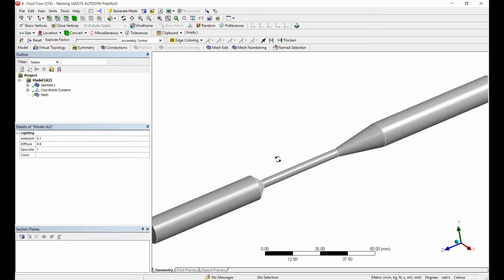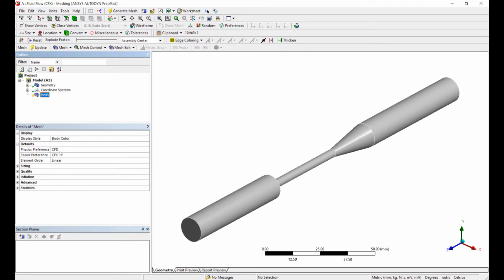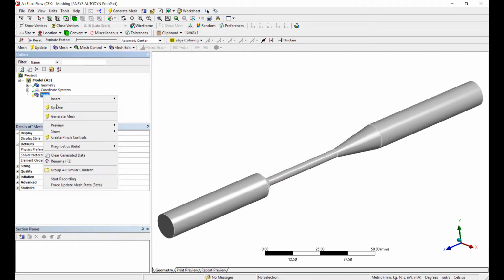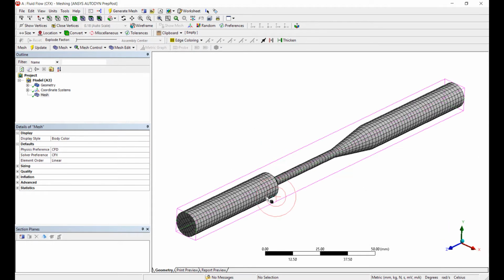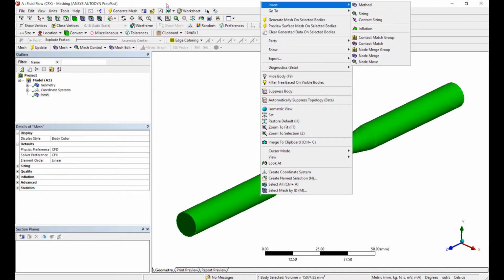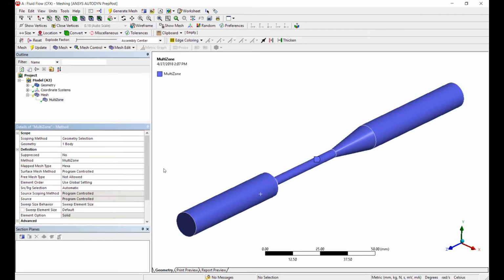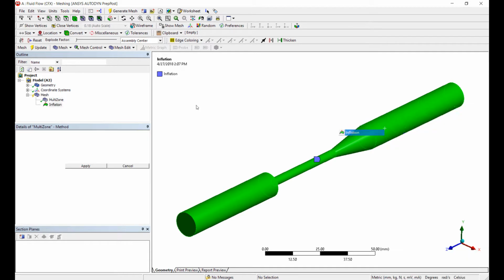So we've loaded the geometry into the meshing tool. The meshing tool is physics aware, so it knows that we're trying to do a CFD mesh for the solver CFX. All we need to do is define the standard mesh will be a tetrahedral element mesh. That should be a hex mesh here, but we have many different hex meshing algorithms. Instead of the standard sweep method, I'm going to use our multi-zone method. And with the multi-zone method, I will be assigning some boundary layer resolution.